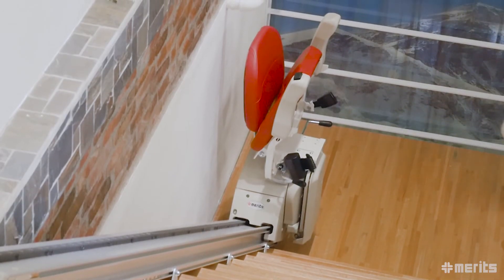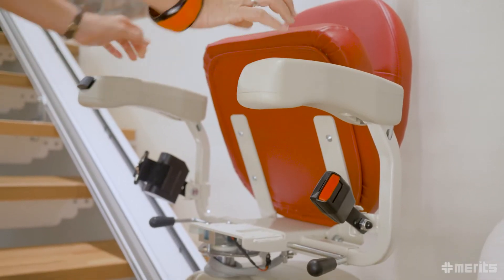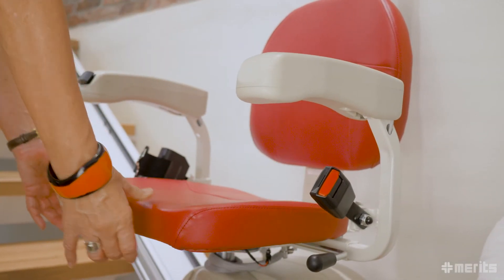The seat, armrests and footrest fold up and allow normal access to the stairs. When needed, the E603 then quickly and easily unfolds.